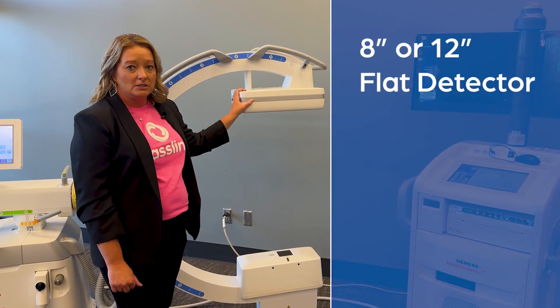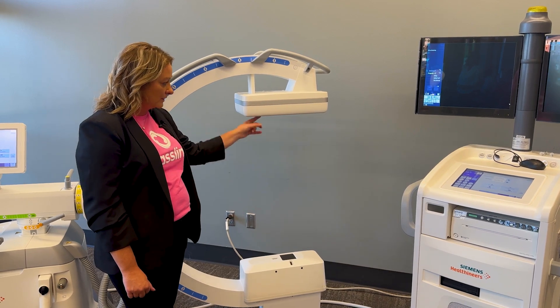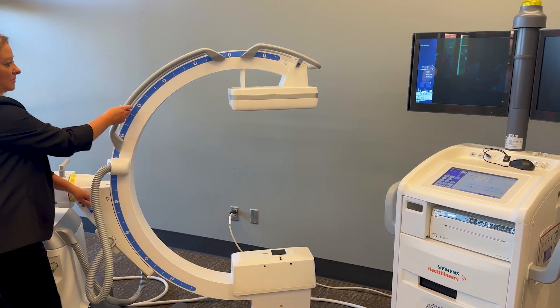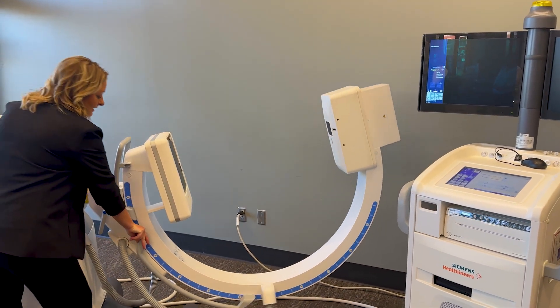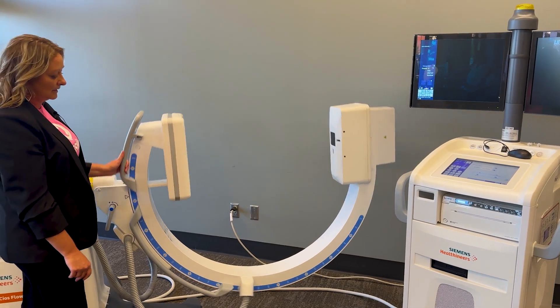It comes in an 8-inch flat detector or 12-inch flat detector. It has a large free space and large immersion depth. You are able to rotate past 90 degrees to 110 degrees to get a true lateral on those patients that you need to.